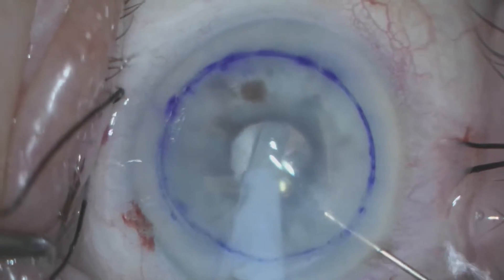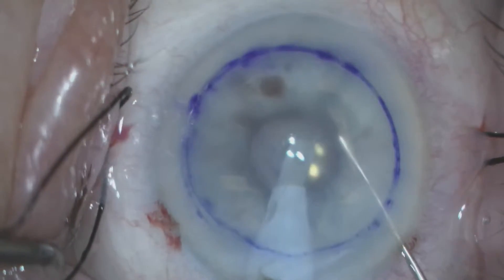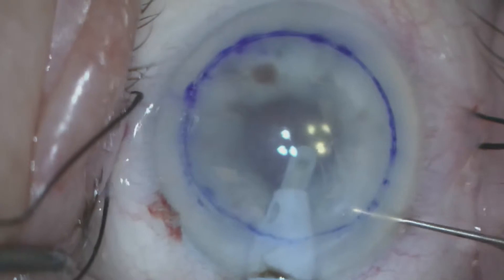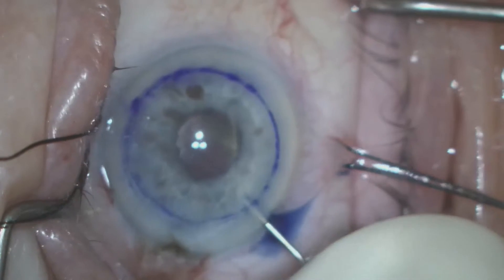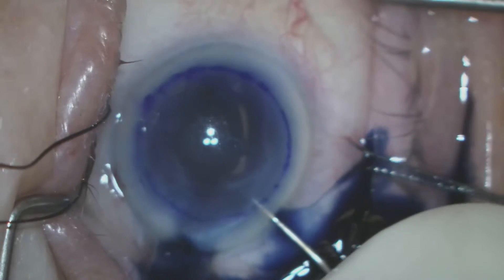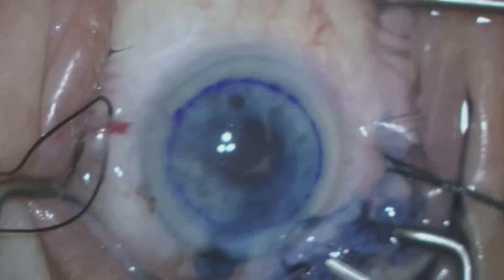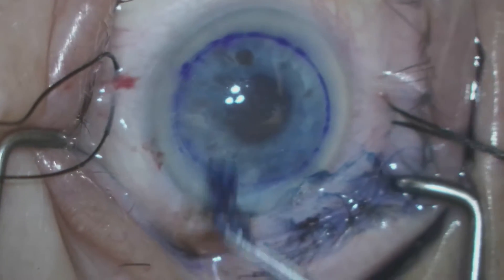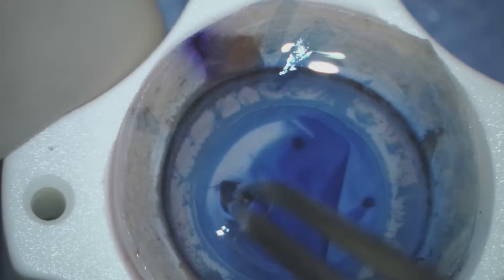We place an irrigation and aspiration cannula in and begin to peel away Descemet's membrane and the layer of endothelial cells which are not functioning at a level to enable this cornea to remain clear. In order to facilitate visualization of Descemet's membrane we infuse Vision Blue, which stains the Descemet's membrane as well as any residual fragments.